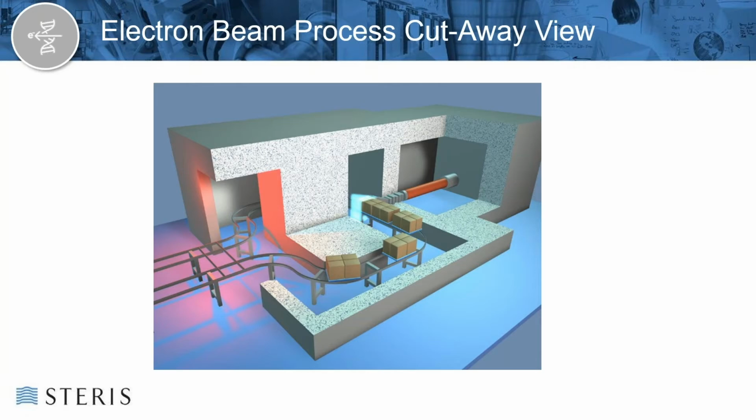The product cartons are on trays there. Now, if you look in that lower left, there is actually a little transit zone that transits products from the input to the output conveyor. This sort of feature can provide for two-sided irradiation. The products would go through the process once, go through that little transit, those two bars in the lower left, and pass through the process a second time with the opposite side of the product load facing the electron beam.